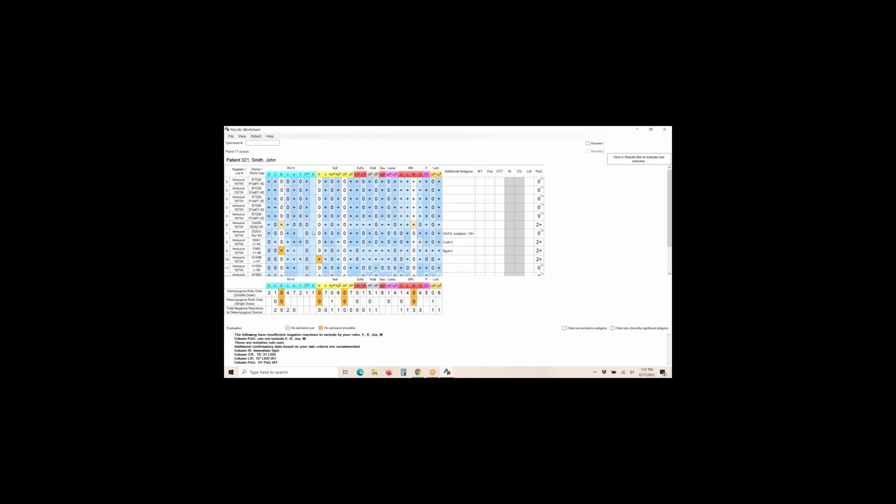And you can see we have more and more dark blue. And let's just go through this real quick. So for D, it says we have 3 rule outs that are double dose. You know, with D, it's a little hard to tell dosage, but we consider all D positives being double dose. And we have 1, 2 that are dark blue, and your third one is here. So that's where the 3 comes from.